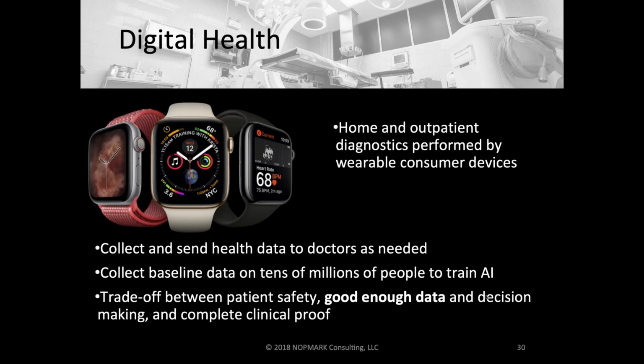So I did want to talk about the big thing on digital health that made big news over the last month, which is the Apple Watch. Some of you, if you looked at the announcements or the keynote, would have noticed that Apple has received FDA clearance for the ECG app, and they have multiple clearances going on. So that ECG app is a medical device. It's a Class 2 medical device. They took it through a de novo process, and they got approval under a medical mobile app categorization.